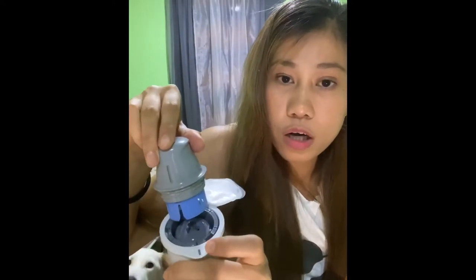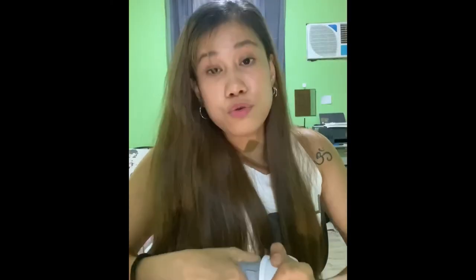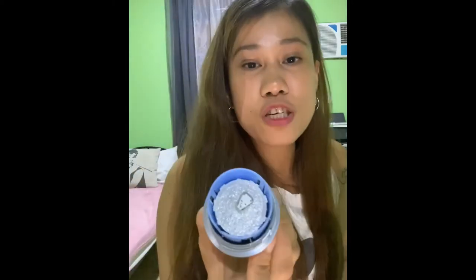This is the sensor and this is the applicator. These two bumps here need to align — they should be level with each other. Then it will click into place like this, and you lift it up.